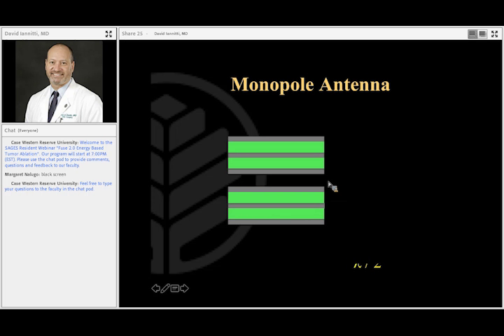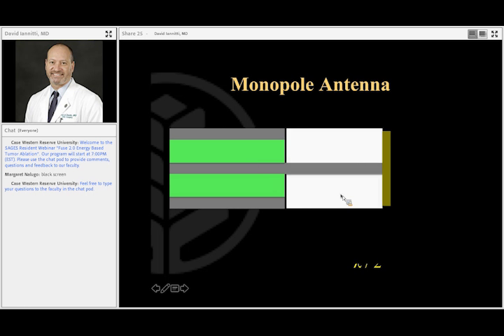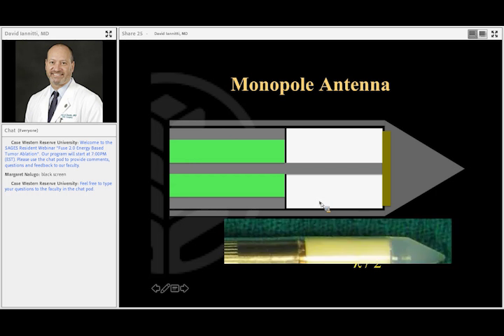So we've improved over the time, and so the next generation of monopole antennas, basically we put a reflector on the end to try to keep the microwaves back, so we're trying to reflect the waves backwards, and we can coat that with ceramic, and ceramic is completely invisible to microwaves. And then you can surround that whole contraption with a PMA type of plastic, which is also invisible to microwaves. So this gives you your rigidity and a nice point, and you can stick that into tissue. And that's what a commercial product looks like. We help build these things. So that's a monopole antenna.